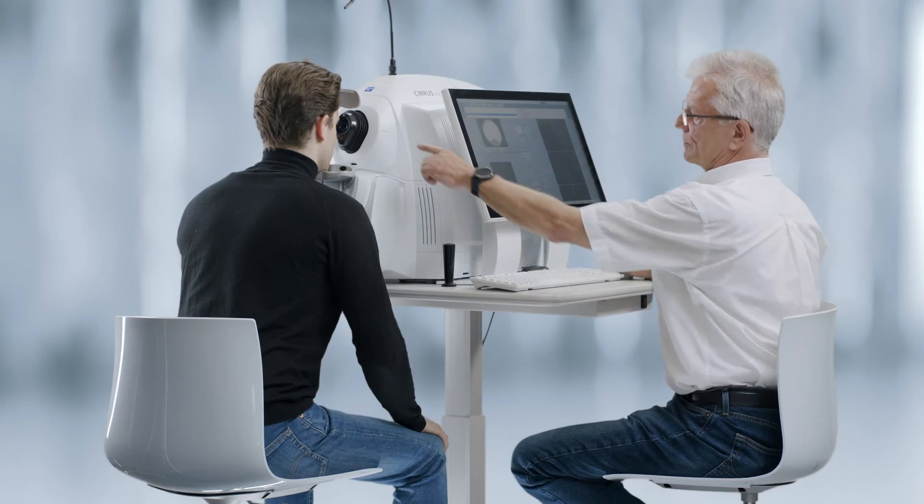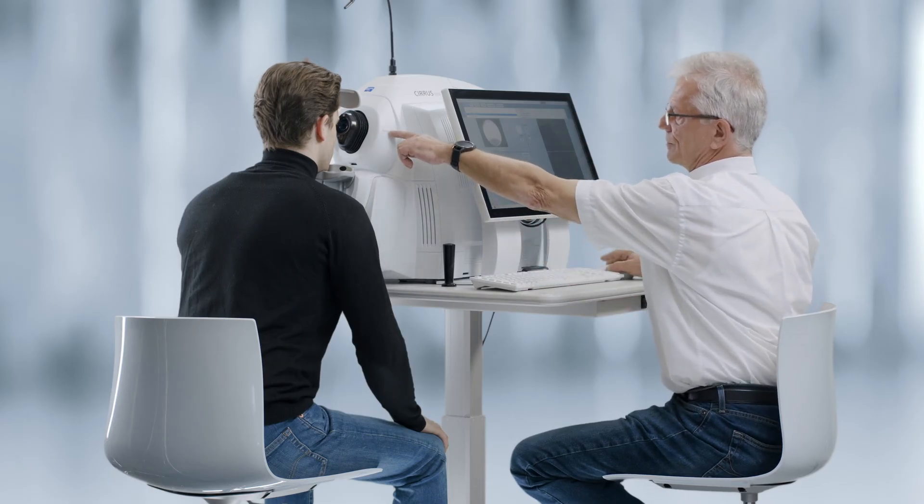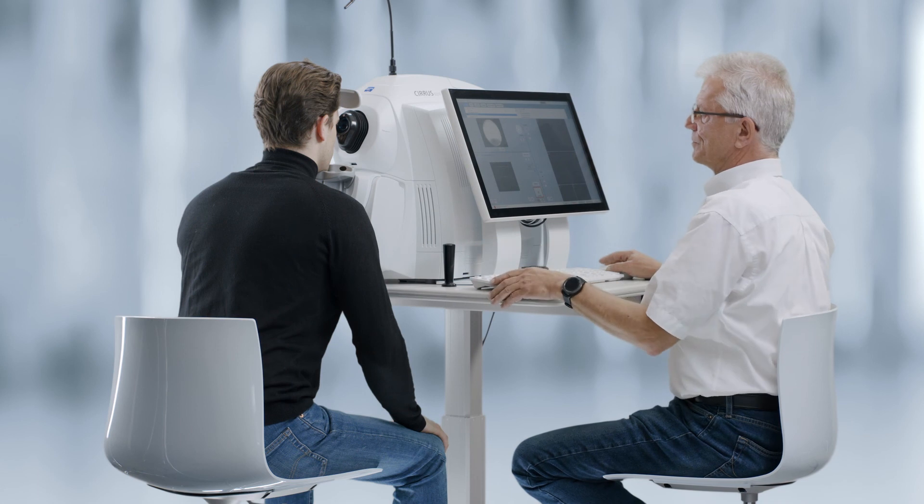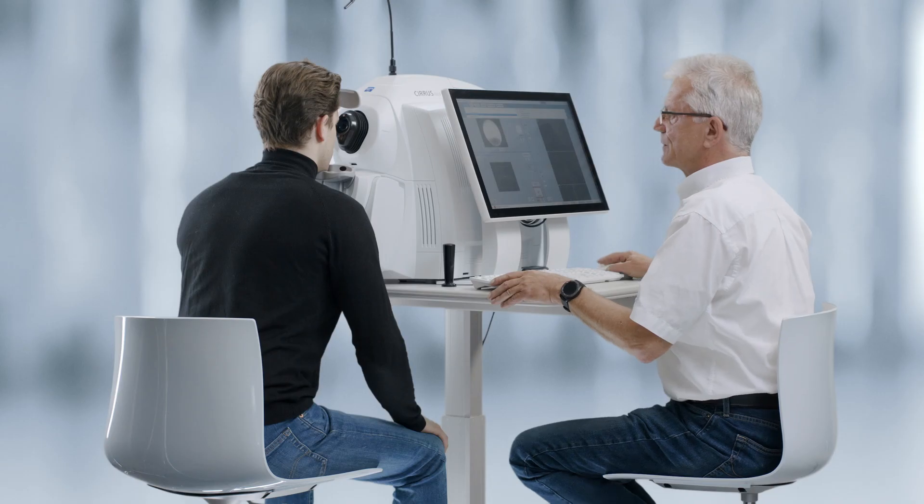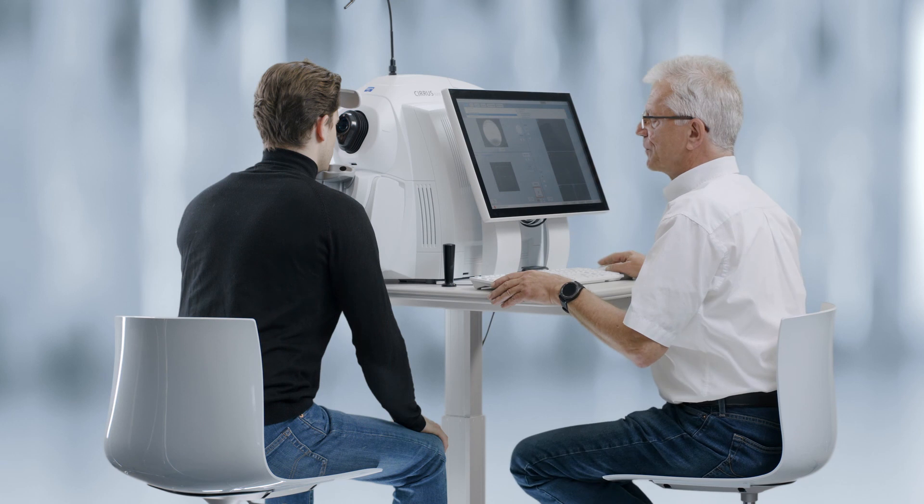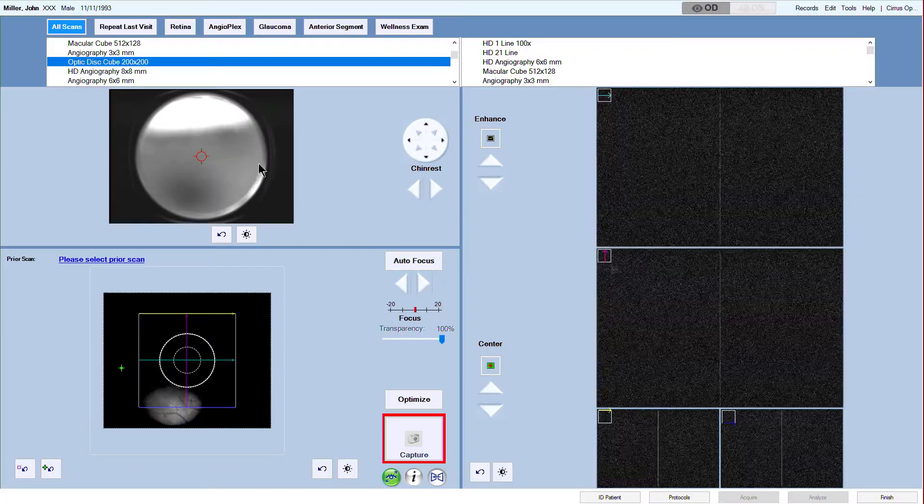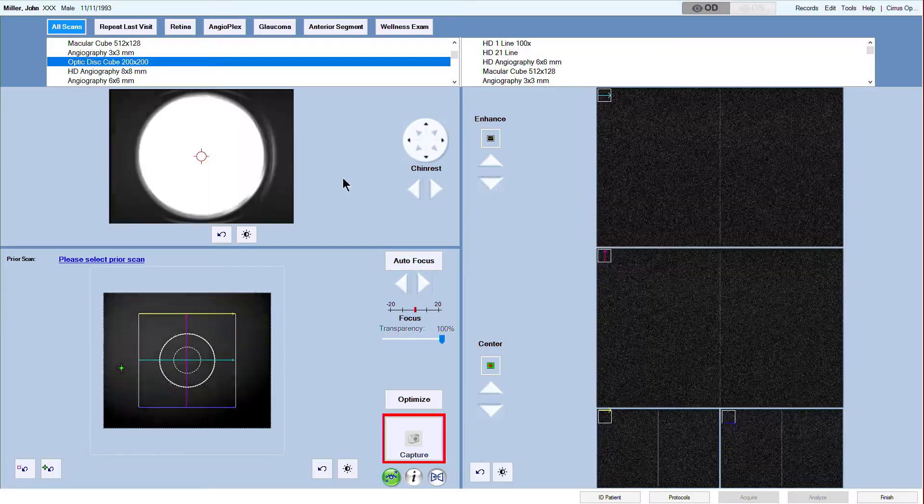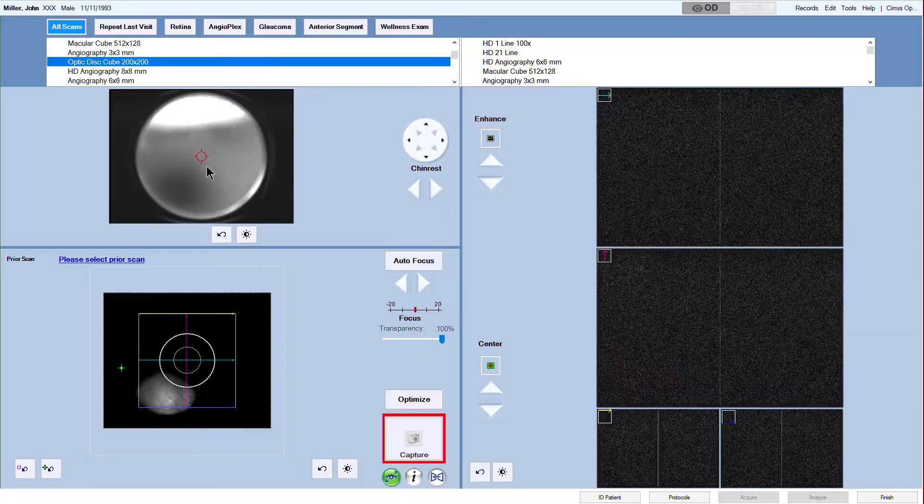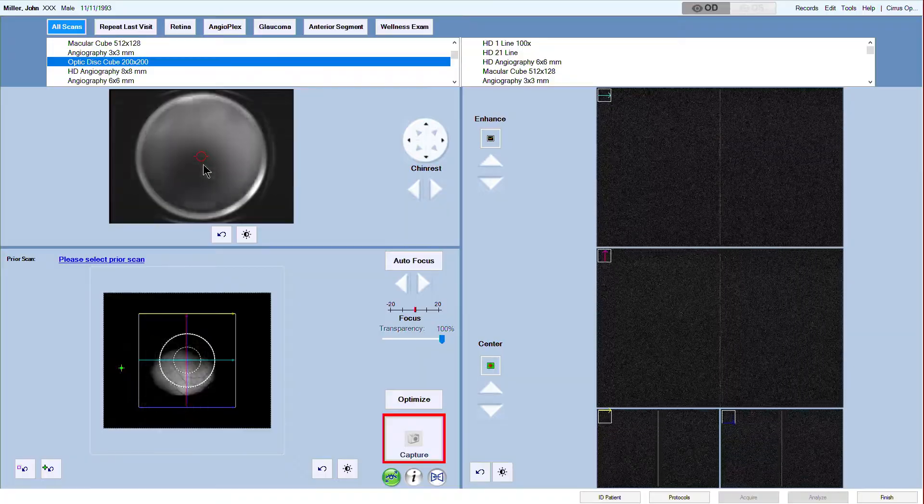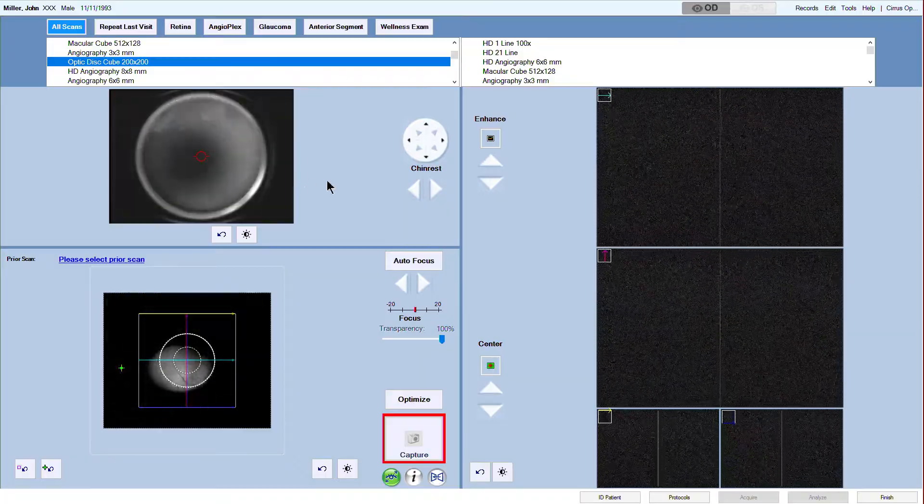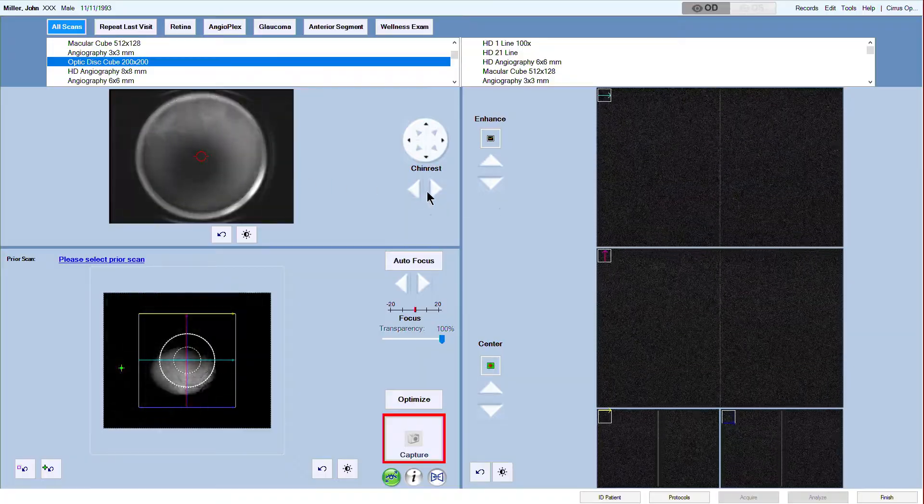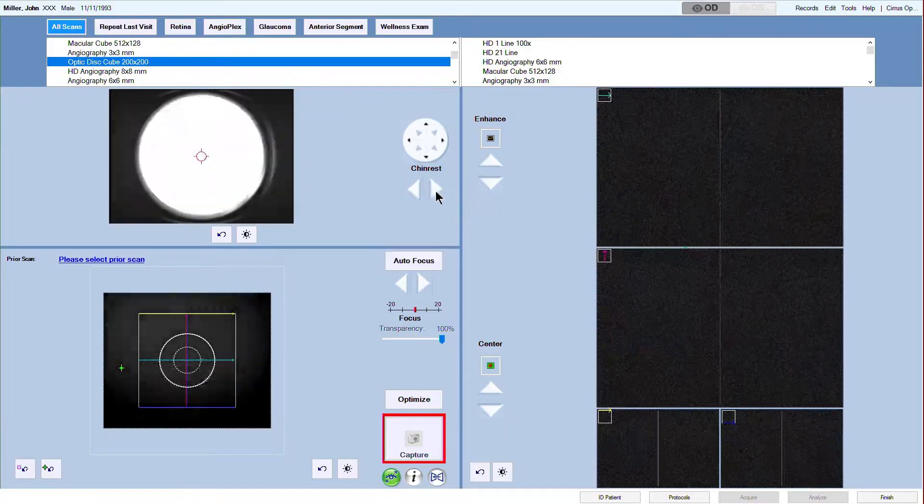Proper alignment of the patient eye to the marker is crucial to obtain a good scan. Instruct the patient to first look straight into the imaging aperture and focus on the green star fixation target as soon as he or she can see it. For the right eye, the green star will appear to the right of the center position. Ask the patient to blink naturally throughout the alignment process.